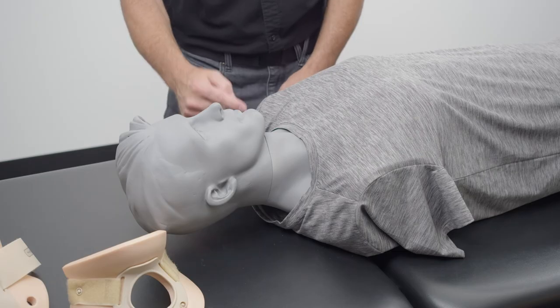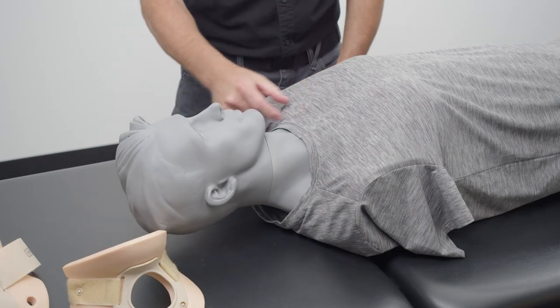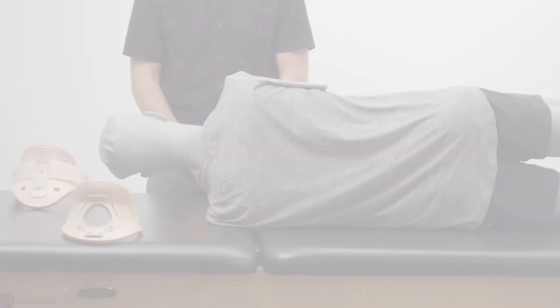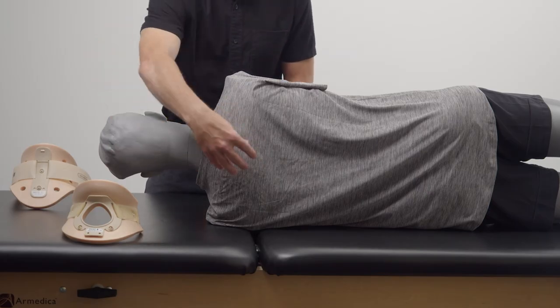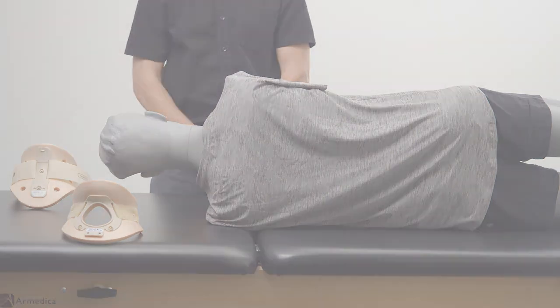Inspect the patient's jawline, clavicle, and sternal area for any pressure problems. Once the patient has been properly log rolled in accordance with correct hospital C-spine protocol, check areas such as the occiput and C7 for any potential pressure problems.